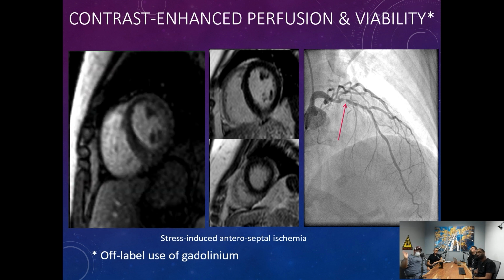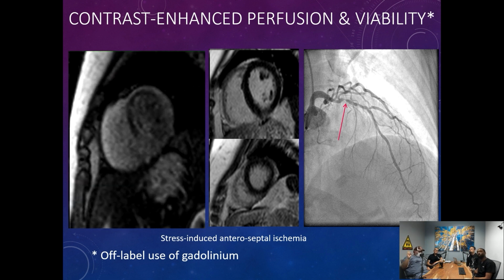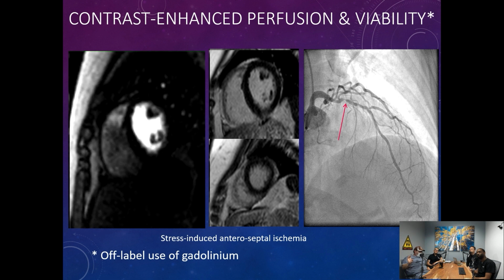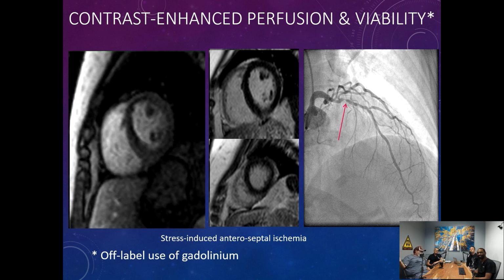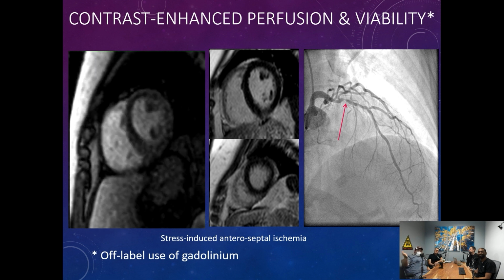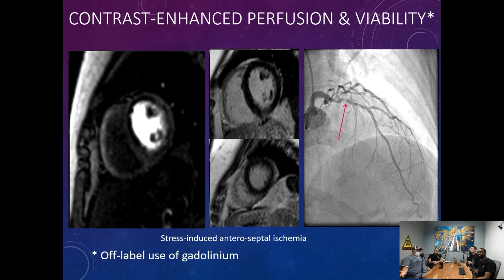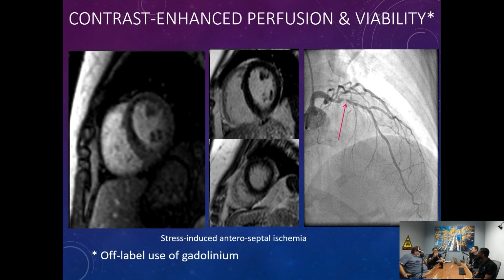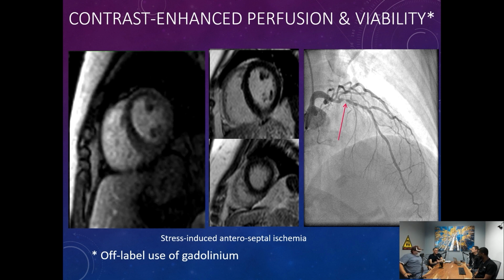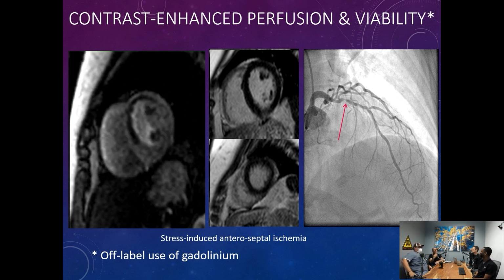I don't want to say the heart doesn't enhance. It does enhance. We're just trying to null it out. We're specifically targeting normal myocardium and saying, let's make the normal myocardium black. Because there's contrast in the myocardium. It's alive. It's not in the myocardium proper, it's in the capillary beds inside the myocardium, of course. In fact, the heart enhances, but then the gadolinium escapes and gets eliminated by the kidneys. It's the fact that it remains stuck and can't escape that determines the pathology.